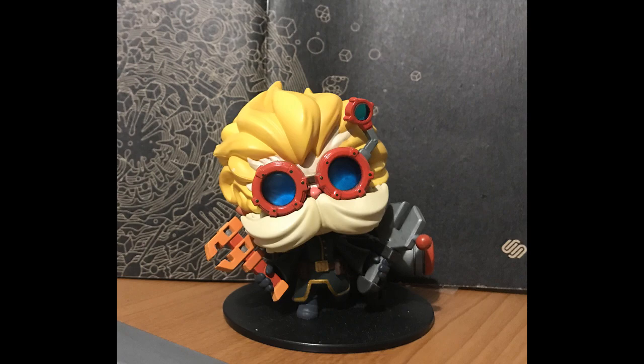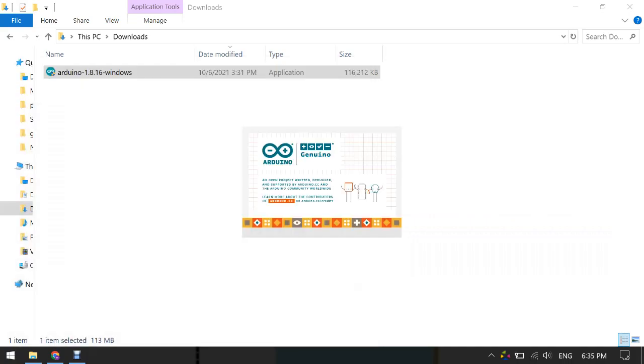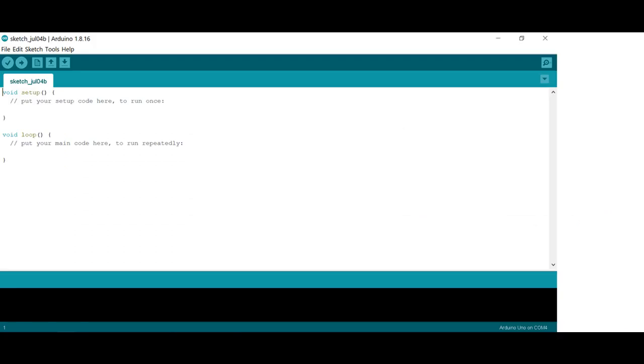Before we write the code, I would like to apologize again. Somehow the software is not working very well and it stopped doing the screen recording. So what I'm gonna do is I will do the screenshot and I will explain as much as I can. And it's very simple, so you can follow very easily. Go to menu, click Arduino, and you will see this first screen. And we are going to delete everything and we start programming our own.